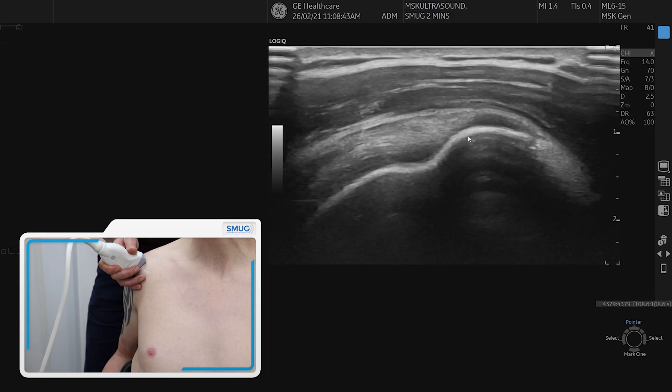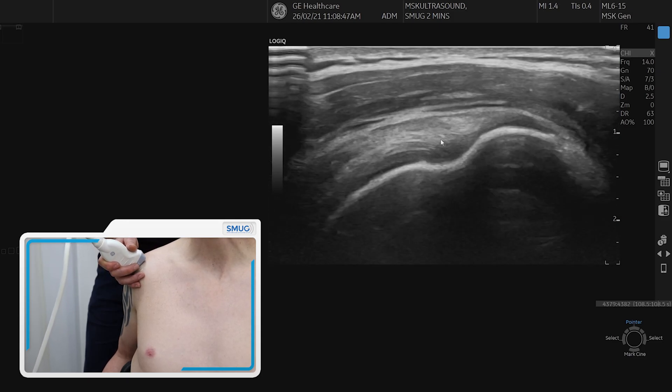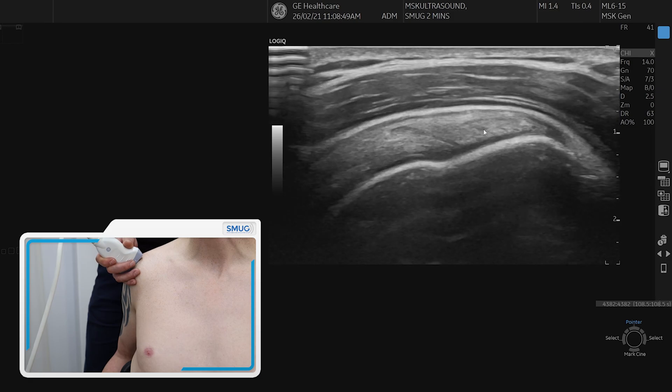It's important to scan through supraspinatus all the way from the long head of biceps through to where infraspinatus comes in.